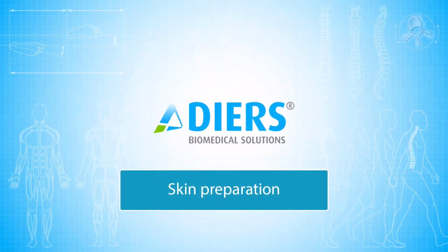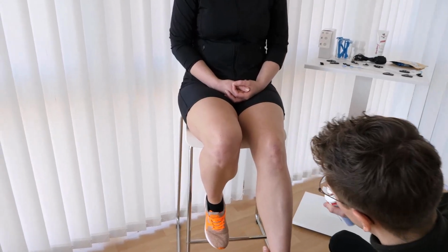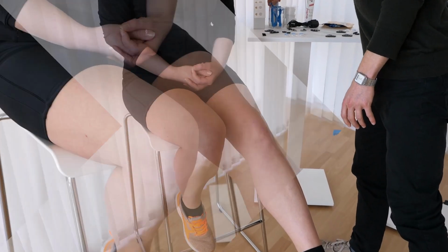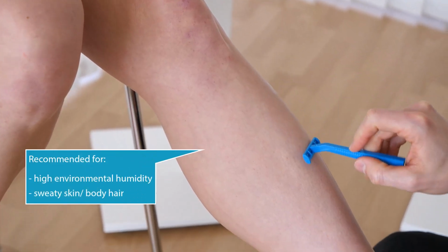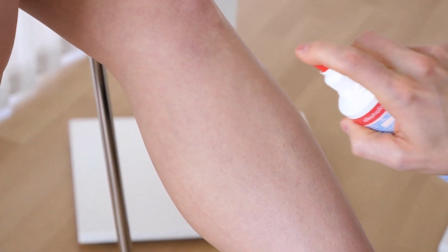Before taking care of the electrode application, we first prepare the patient's skin. The first step is not absolutely necessary. A shave is performed in order to remove hair from the patient's skin. This ensures that the electrodes adhere well on the skin even during dynamic movements. The tibia must also be prepared, as this is where the reference electrodes are placed.